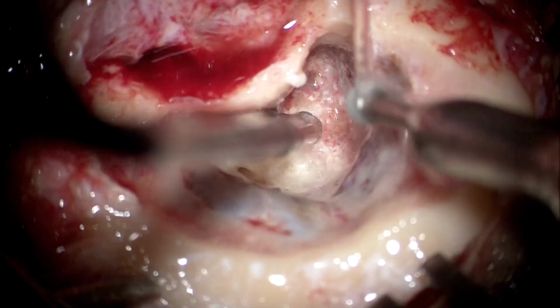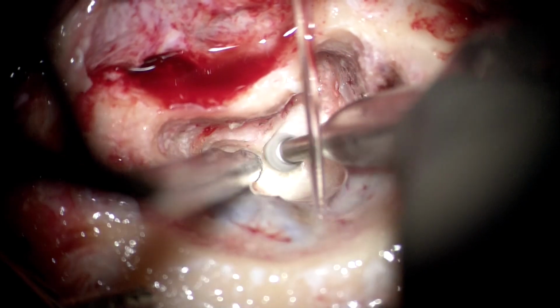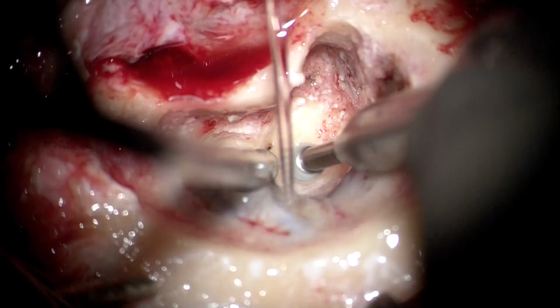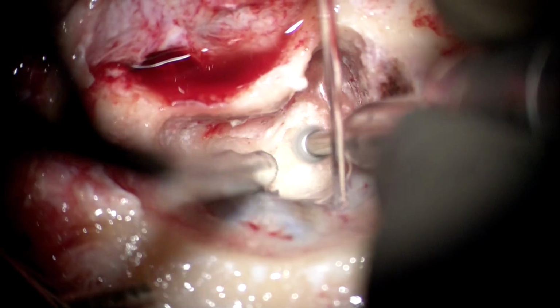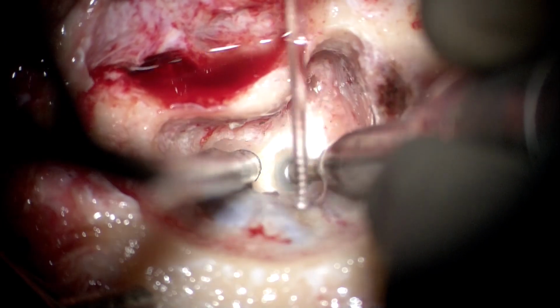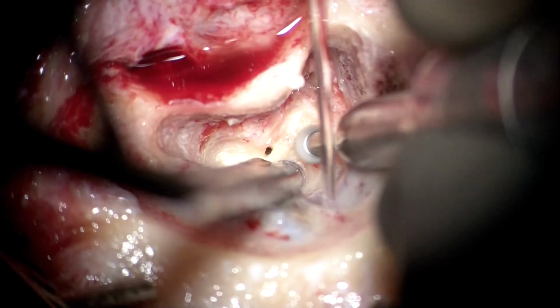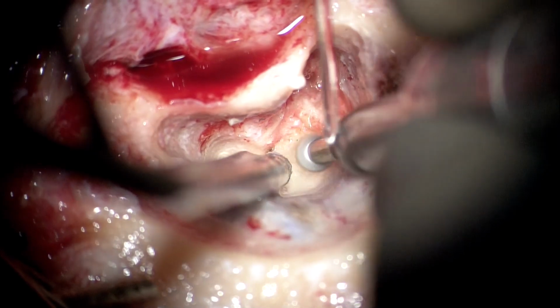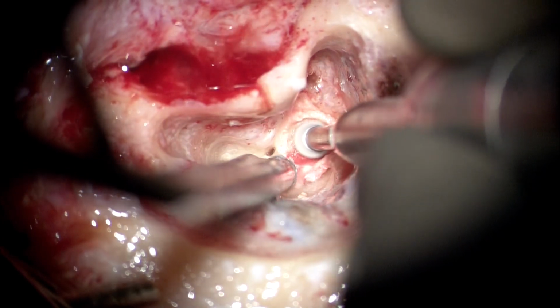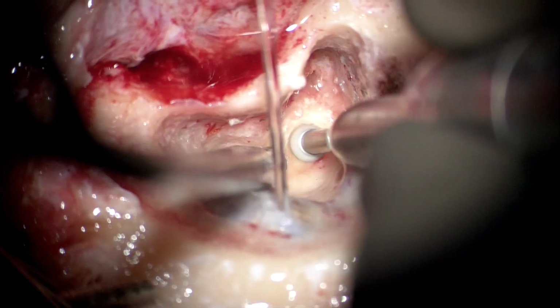Further drill the lateral canal like so, and now one can see the entire shape of the lateral canal. We can start seeing the non-ampullated end inferiorly. The ampullated end lies superiorly. And now, if you just see carefully, we have opened the subarcuate vessel, which is intimately associated with the superior canal. That often leads to some bleeding whenever we are drilling the superior canal in any translabyrinthine procedure.